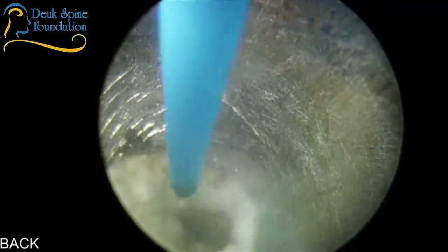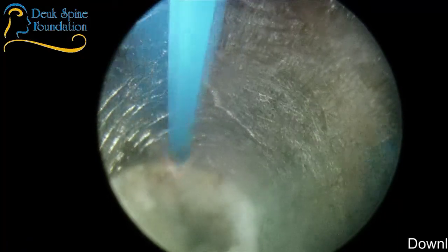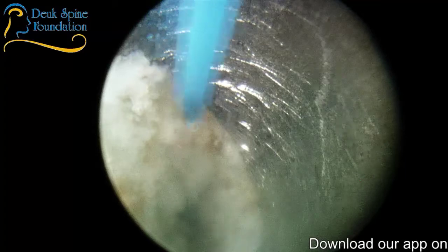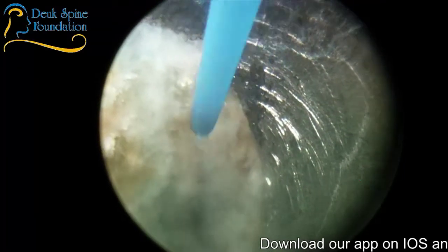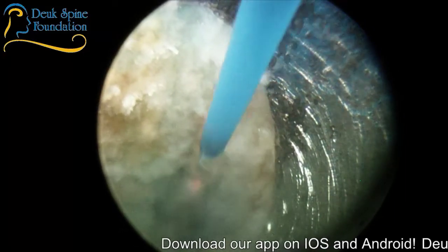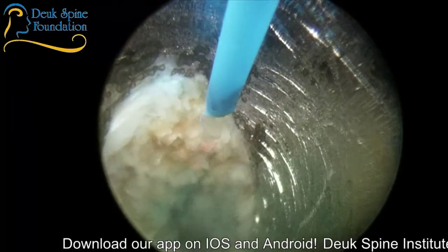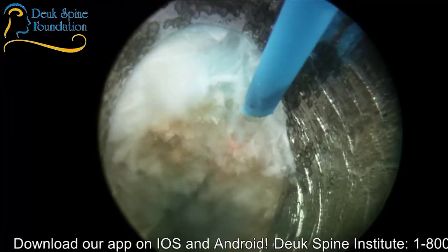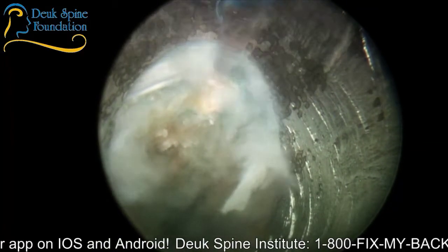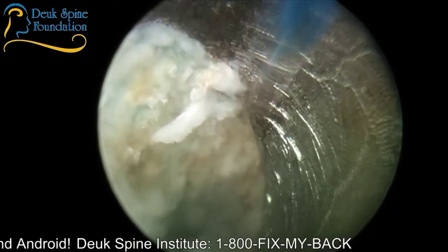Well, the body will seal it. The patient's body will seal the tear itself. You see, the reason they have back pain or neck pain, if this is in the neck, is because they've been trying to seal this tear for a long time. Ever since they started having pain, that's their body's effort to seal the tear. But they couldn't because all this junk was in here. Now that I'm cleaning it up, they're going to be able to seal this tear without this nuclear material being here. So actually, the patient will seal the tear themselves, all natural.